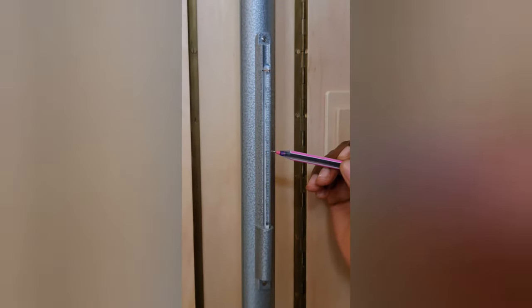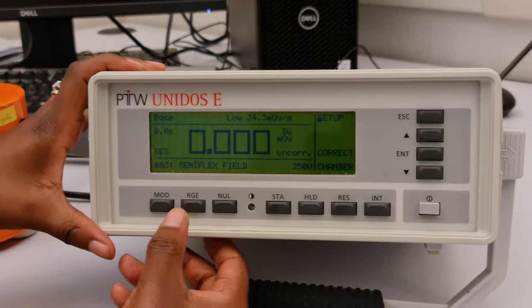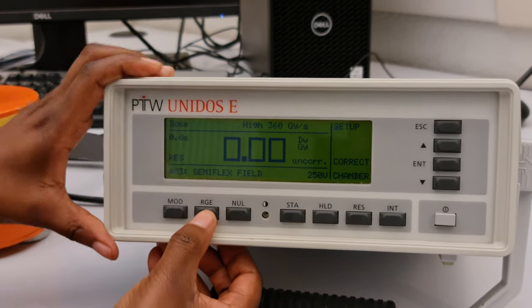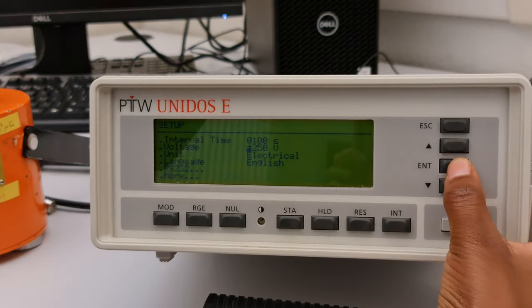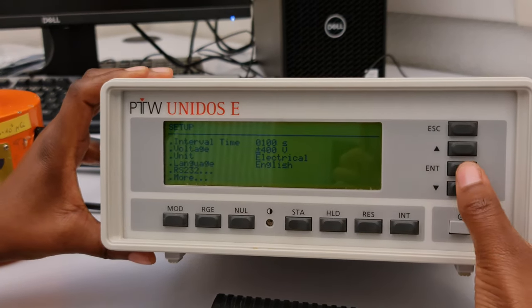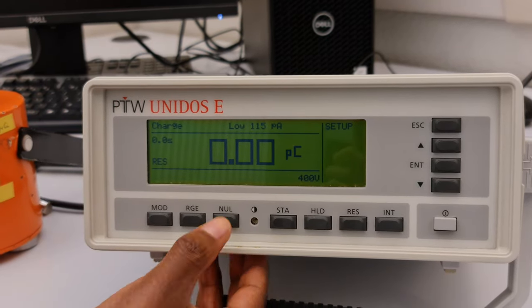We start off by taking the pressure and temperature readings. In our department we use a wall thermometer-barometer. Then we go on to setting the electrometer ready to take the measurements — the range is set to low because we're using a radioactive source. We set the interval time to 100 seconds. For the first chamber we are going to use the Semiflex, with a voltage of 400 V, and we're ready to start.